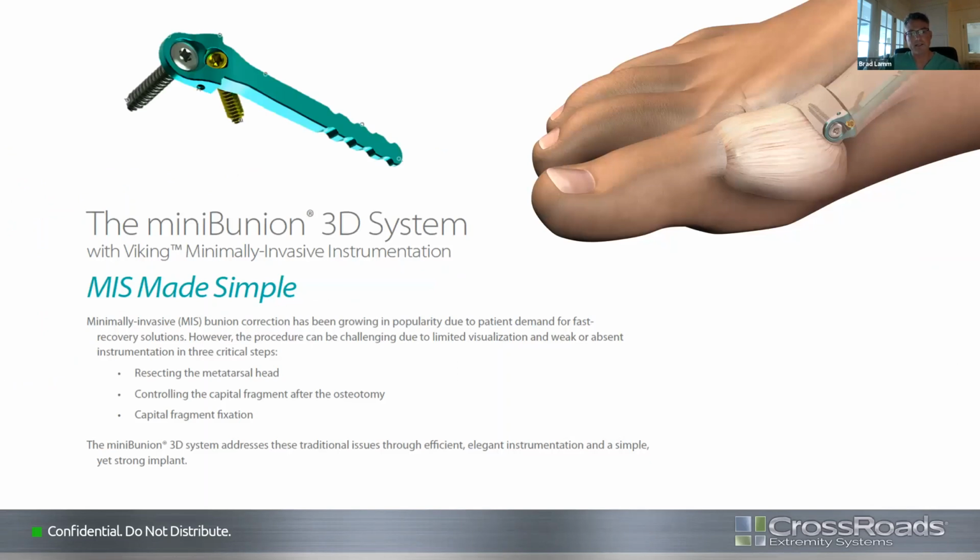And then basically from that I came up with this. I love the technique of not invading the joint and doing it minimally invasive. Patients like that, as well as coming up with a more stable construct that not only would stabilize the osteotomy and allow for earlier weight bearing and quicker healing because of the bone healing, but also having a device that can control some soft tissue correction medially if you wanted to suture the medial capsule, which the implant itself has a hole that you can pass suture through to reef the medial capsule if you so desire.